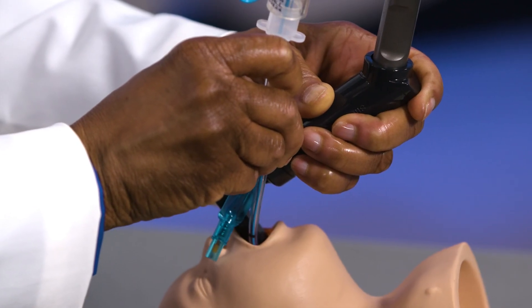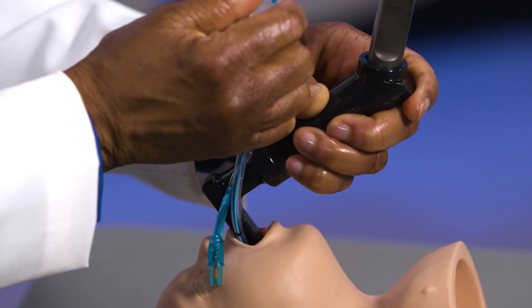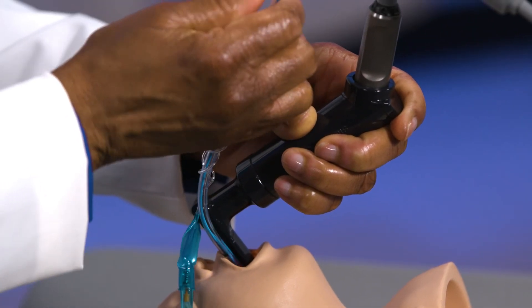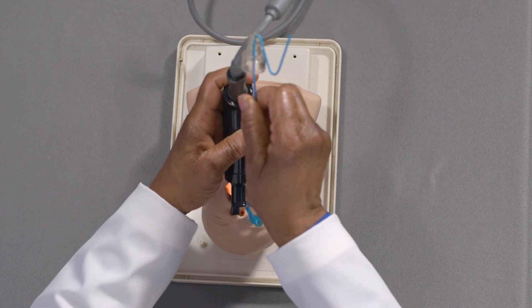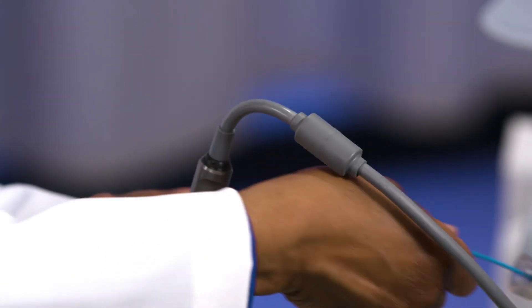Finally, I recommend keeping the video laryngoscope in place during removal of the stylet from the endotracheal tube. As always, make sure that you're holding the endotracheal tube in place during removal of the stylet.